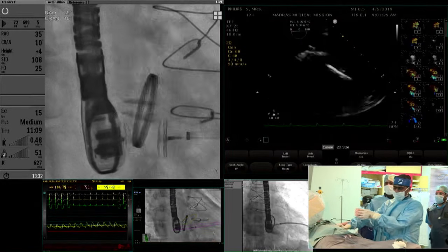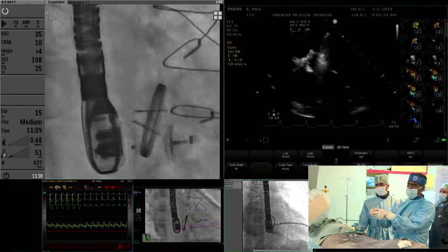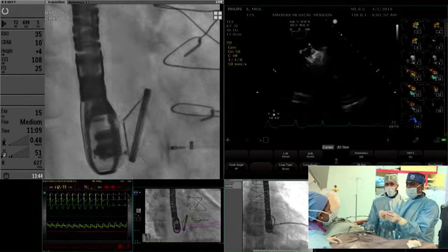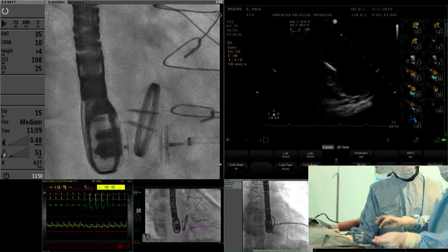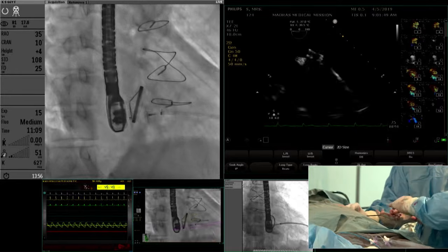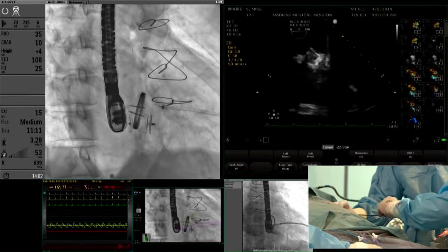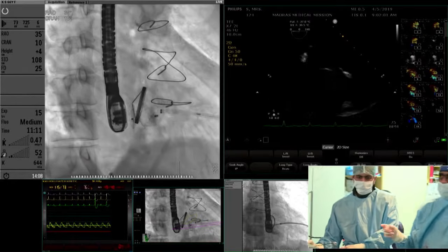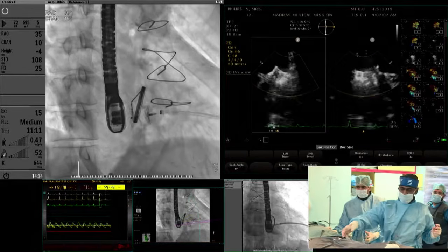Can you also explain what the importance of the timer is? What are you looking for with the timer? Basically, if I feel that our procedure is getting prolonged by more than about 15 minutes or so, there is a possibility of thrombus formation on all the parts of the sheath, the wire, cable and all. So I would like to be quick. Get me a 6 vascular plug. I'm going to be giving heparin. Give 6 vascular plugs, flush sister.